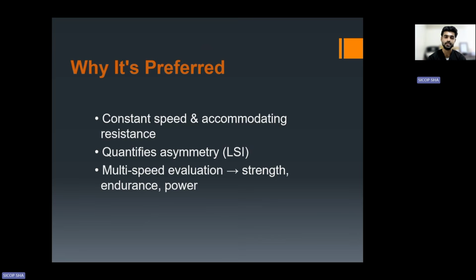Now, while we test the quadriceps strength on the isokinetic machine, we can get the exact amount of weakness directly. So we can see directly 30 percent weakness compared to the right. We can see 50 percent of the weakness from the unaffected limb. So it quantifies the asymmetry. This is the beauty. We can compare the affected leg versus the unaffected leg.